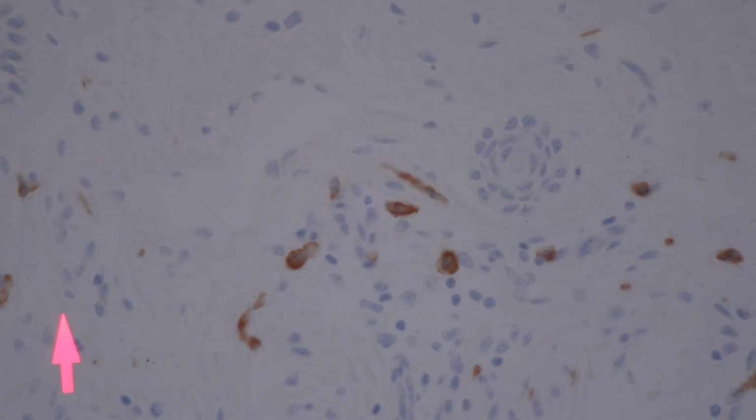And you can tell, I think they stand out a little better here than in the previous example I showed. These mast cells have a little oval nucleus and they've got granular cytoplasm. The granules don't really show up nicely on the video, unfortunately, and if I turn up the light, it'll wash them out too much. But mast cells pick up a lot of different immunostains non-specifically, and the stains I see it most with are pan-cytokeratin, Desmin, myogenin, and MART1, and I'm sure there are others.